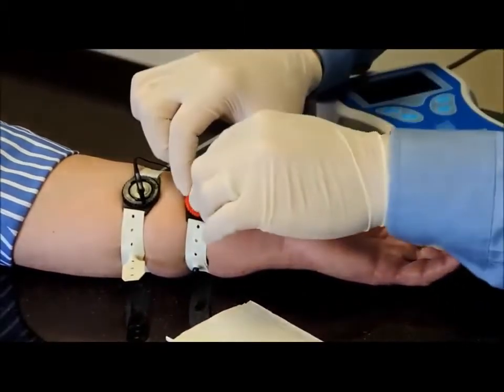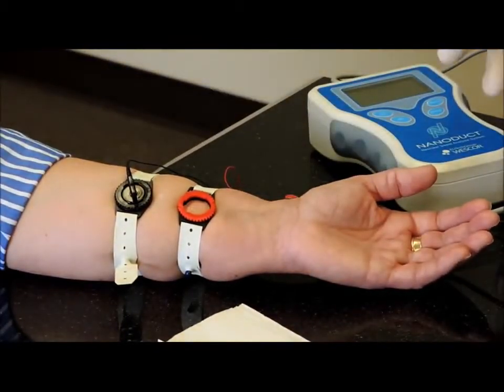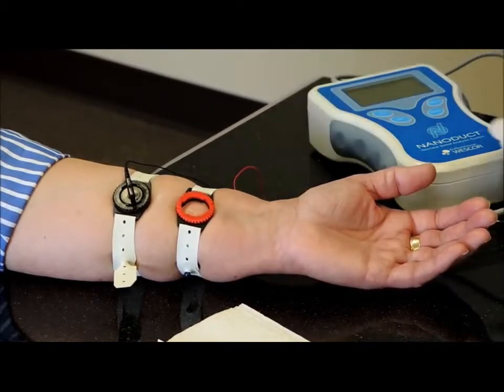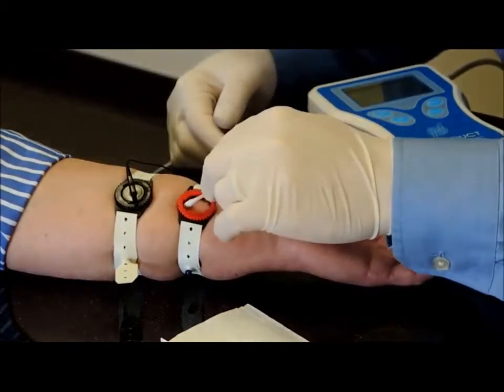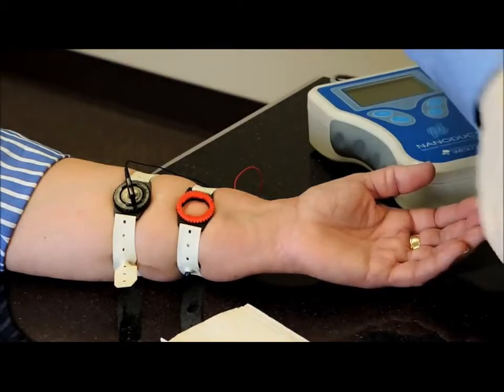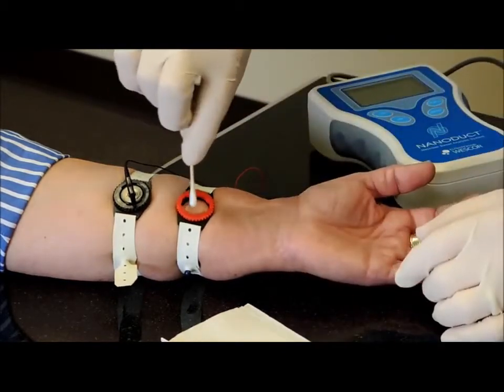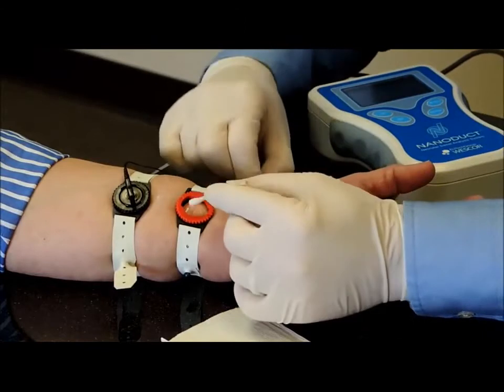Keep the black there. So I remove the red electrode. You'll notice some liquid down there. Some patients or parents of patients will say, "Oh, look, there's already sweat." No, that liquid is liquid from the disc itself, and so we need to clean that off and dry it. And so normally what I do is I take a dry cotton swab and dry that liquid really well. And then I'll take a little bit of water and squirt it onto the skin, and then rub that around to wash off the skin so there's no remaining debris or ions left from the disc.